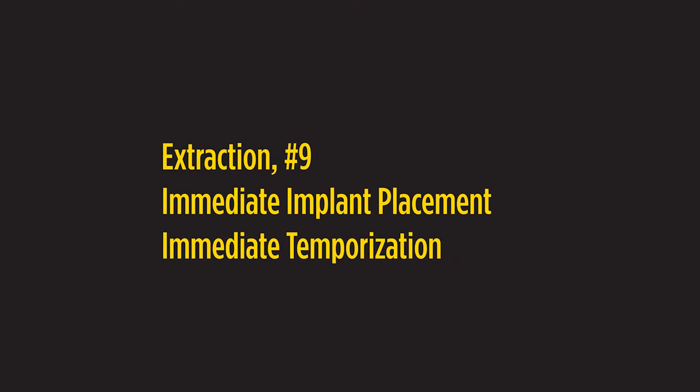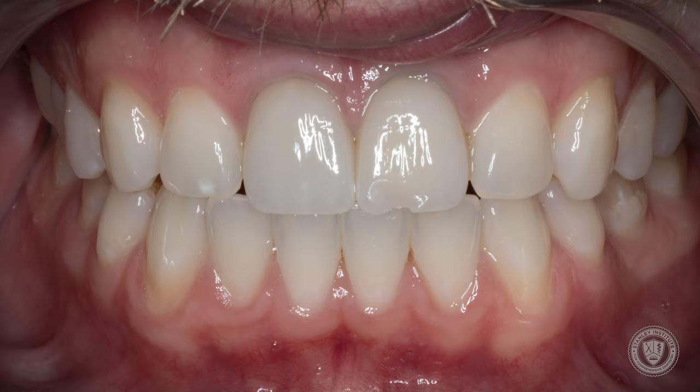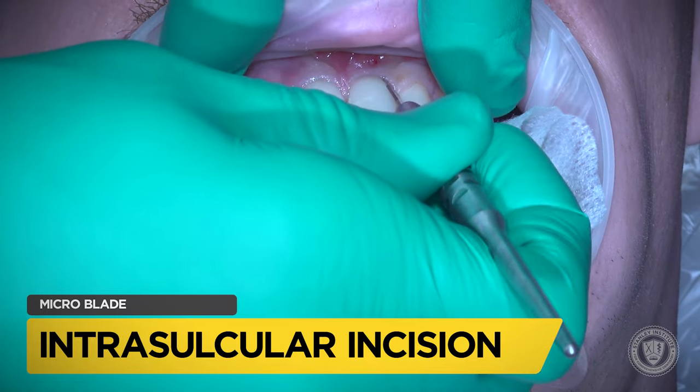Here we have the case of an extraction of number nine and an immediate implant placement. The patient presents with trauma to teeth eight and nine. Today we're just going to be addressing nine, and in the future we'll probably be addressing eight as well.